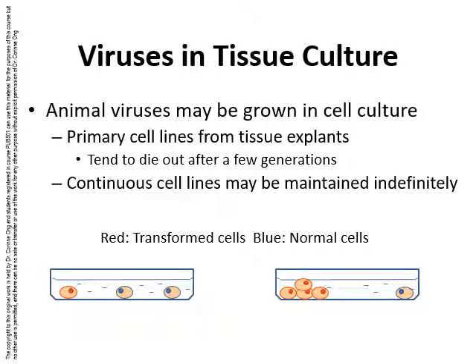Let's look at the practical aspects of how viruses can be grown in the laboratory. This is often required for diagnostic purposes or research studies to advance knowledge on new viruses, and also the manufacture of vaccines. Unlike bacteria, viruses need host cells to grow. Some animal viruses, not all, can be grown in cell culture.